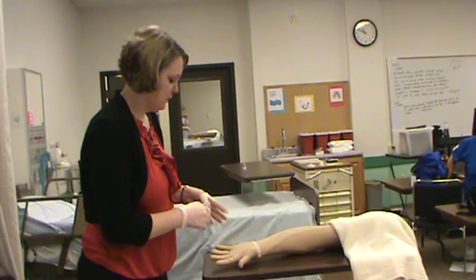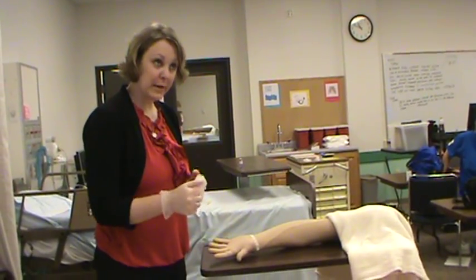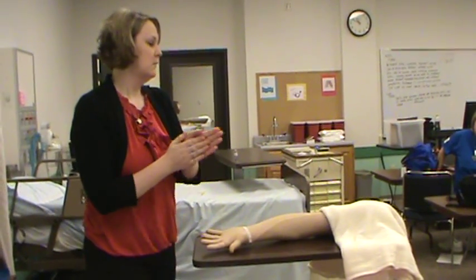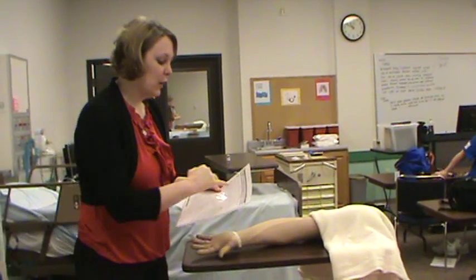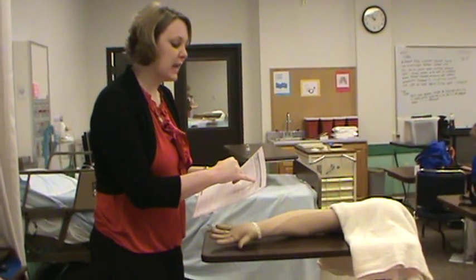Discard equipment in sharps container. So my needle would go in my sharps container, the rest of my garbage. I would take off my gloves and wash my hands. Record the medication properly on the MAR. So again, I will note the time at which I administered the TB test, what site I used, and my initials.